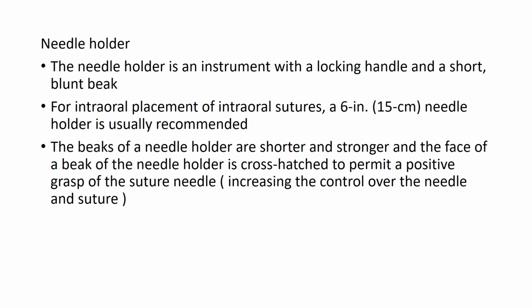What are the instruments needed for suturing? There are basically three instruments needed. One, the needle holder; two, the tooth pickup or tooth forceps; and three, scissors.